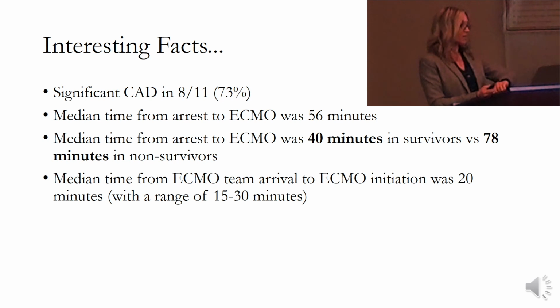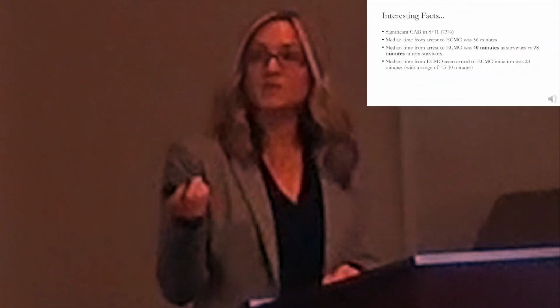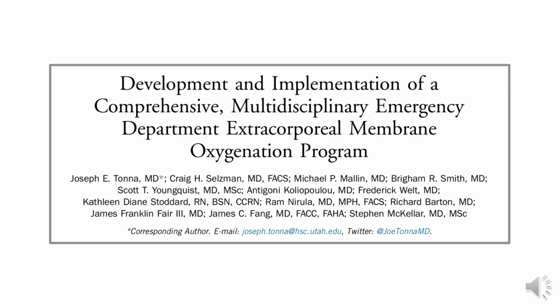So if you take into account the pre-hospital time, the time in the emergency department without ECMO, and the time it takes to cannulate, you're looking at a pretty significant chunk of time. And so the goal is to try and figure out how we can decrease the time to get these patients on pump as soon as we can. That way we can increase their survivability. So taking this into account, another study was published in Utah.